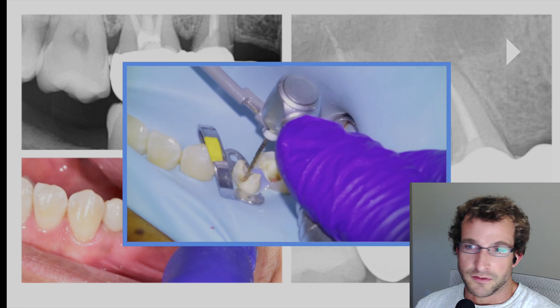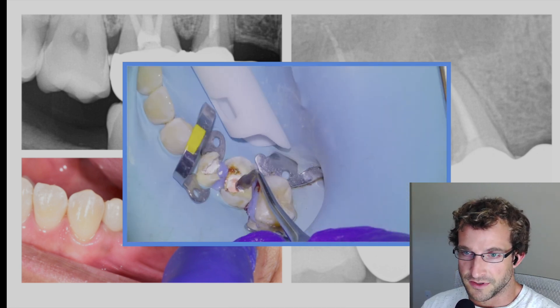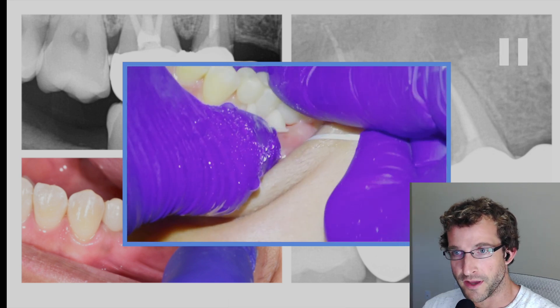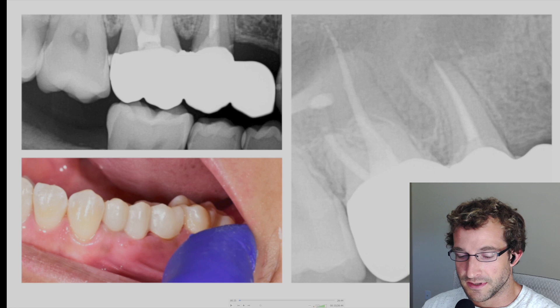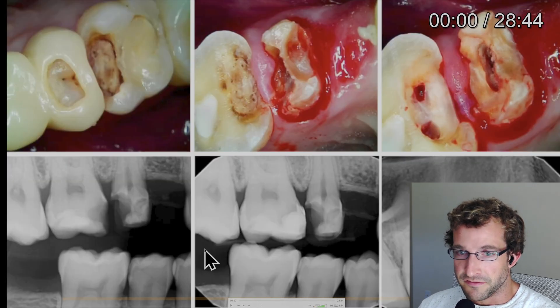Hey guys, Dr. Dobson. We're going to go over a case in this video. Here's some trailer footage — it's a 1-6, 1-5 endo and crown prep and then a cantilever bridge. Here's the final result and we'll go over some introductory footage here.